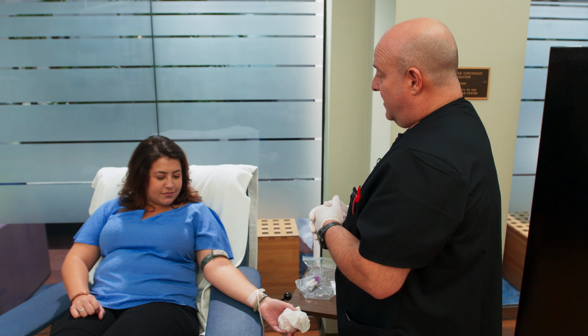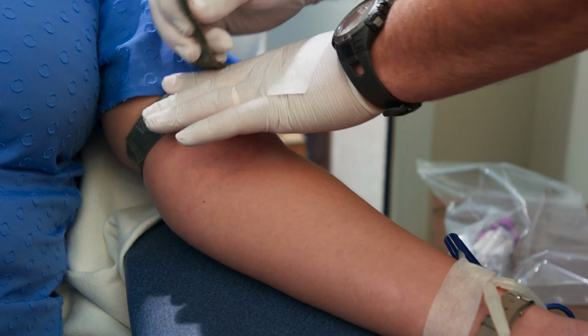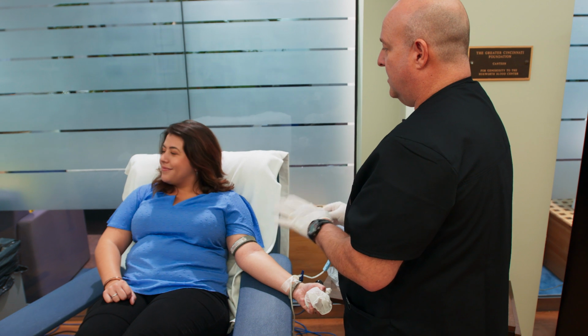All right, you're all dry. You ready to go? I'm ready to go. All right, let's tighten this up and get you going. All right, a few good squeezes for me. All right, just make a fist and hold it. Turn your head if you don't want to see the needle.